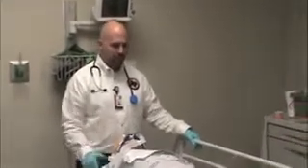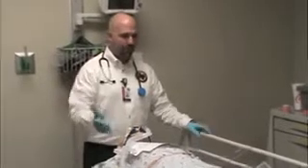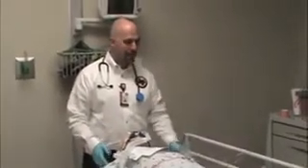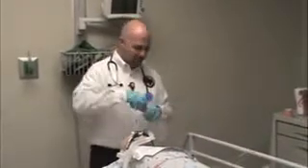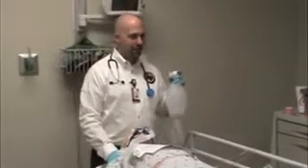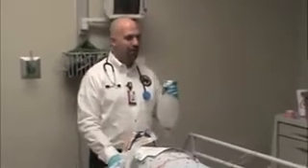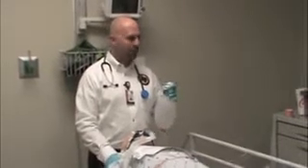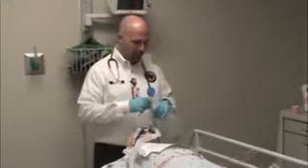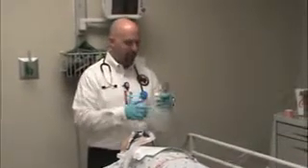If you think there's a problem with the ventilator, take the patient off the vent and see if they'll tolerate ventilation with a bag valve mask. Some patients with really, really sick lungs don't like BVM ventilation, especially if we don't have a PEEP valve attached to the BVM. So if you have a sick patient that's required a lot of oxygenation, a lot of FiO2 or a lot of pressure, and a lot of PEEP, you're not doing them any favors by removing all PEEP when you go to use a BVM.